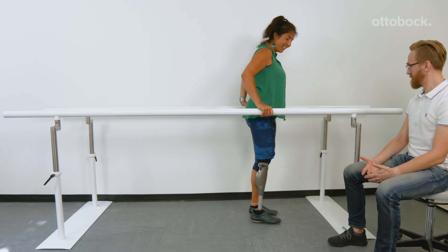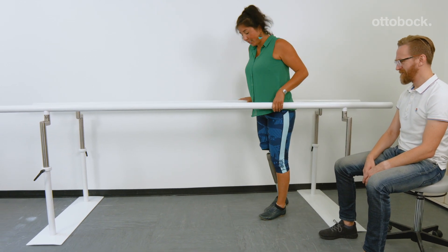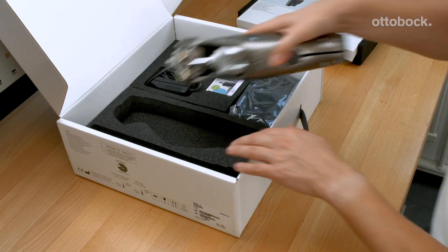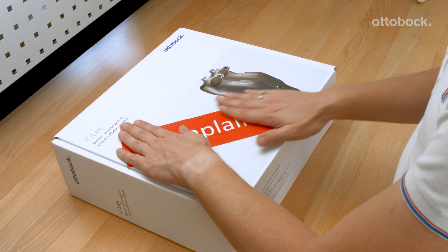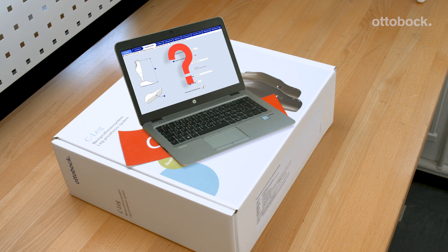The behavior shown here is not a malfunction of the knee joint. It indicates that the knee joint is still at the factory setting. If the knee joint does not release into swing phase, do not return it as a defective product to Ottobock before first checking that the user data has been entered properly.